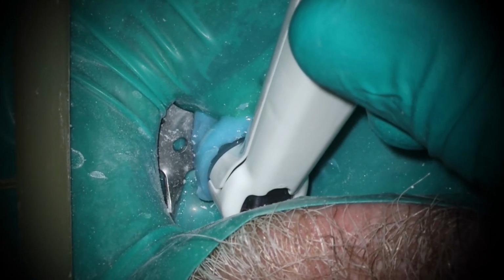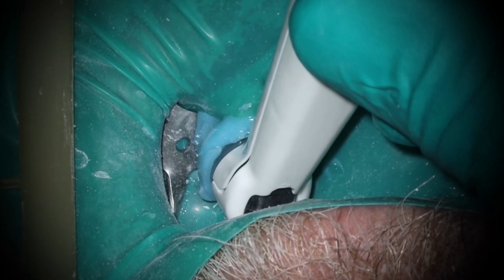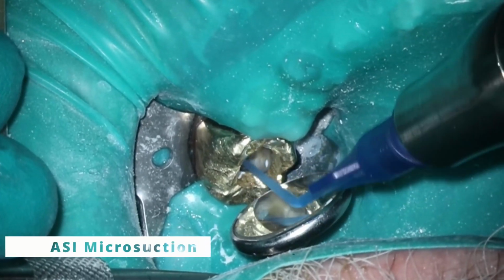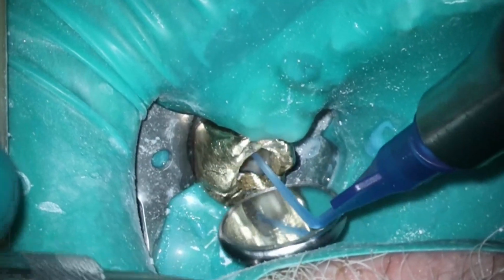So I was able to run the cycle with no issues. We had no problems with it losing suction, anything like that. So good news there. And the cycle went really well. So almost done here. We're going to pop this off. As I'm recording, you should be seeing something a little bit better, but my computer is definitely struggling trying to render all that. So, okay, here we go.